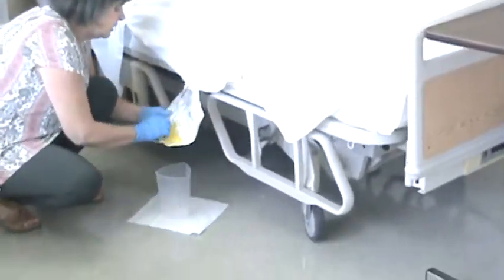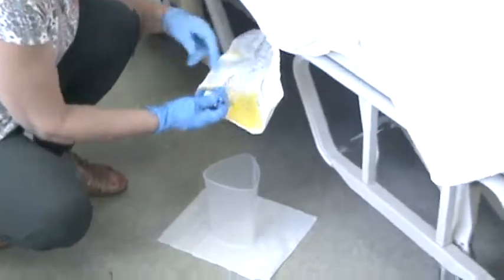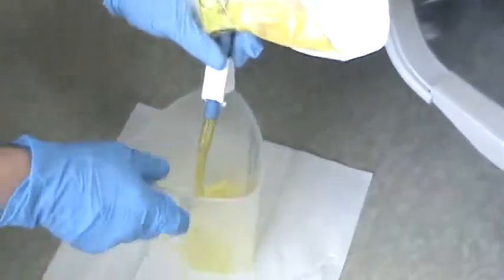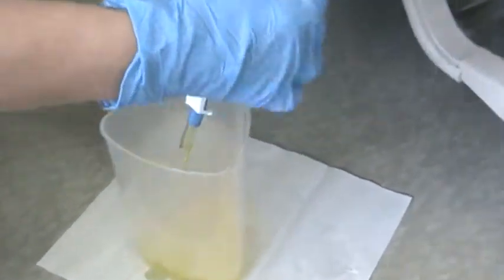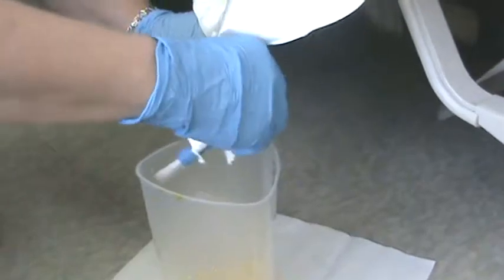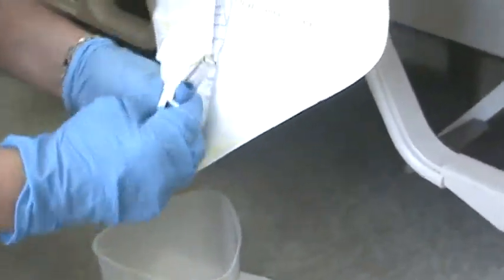Set this on the floor. I'm going to open the clamp and then point it in and drain all of the urine in the bag. Close the clamp and make sure you put it back in its little pocket.